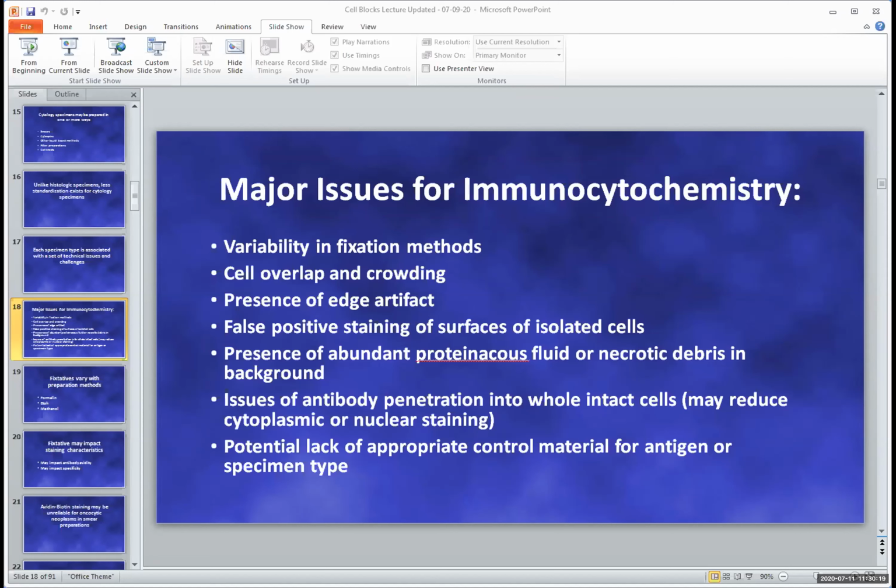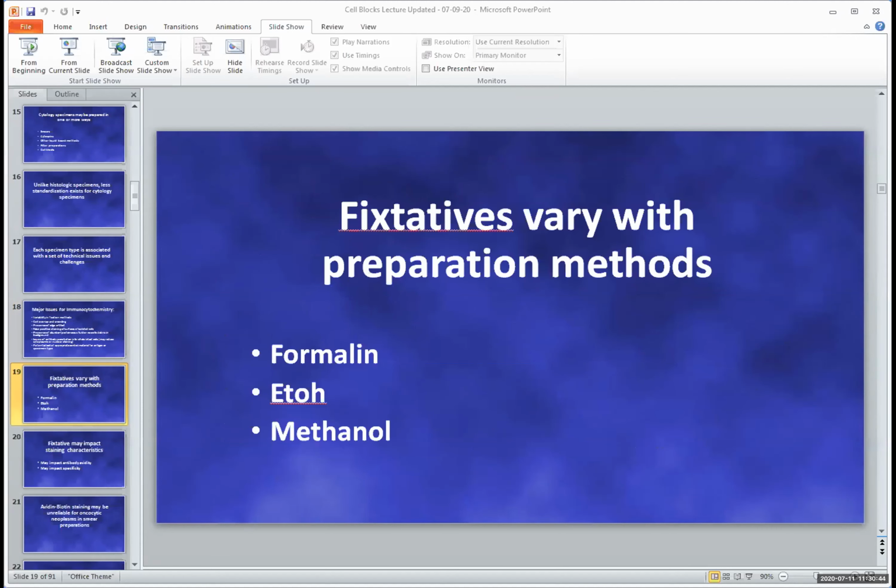control for a smear? It may not be actually formalin fixed paraffin embedded material, and honestly, we just don't have thousands of smears available for all variety of the hundreds of antigens we can do. So that lack of an appropriate library for different types of cytology preparations is, in my mind at least, somewhat of a problem for QA.